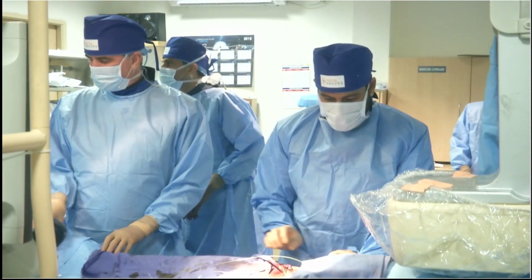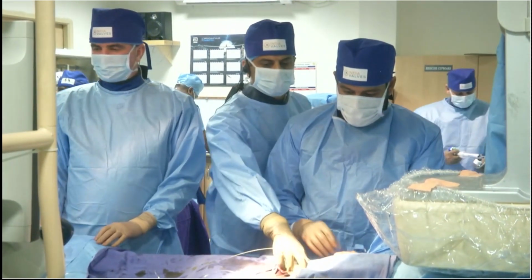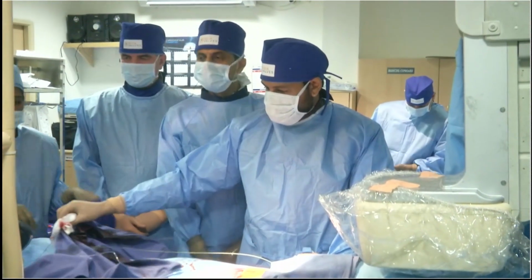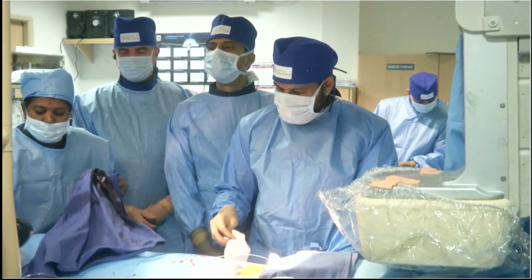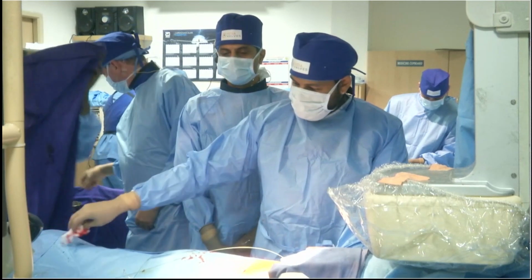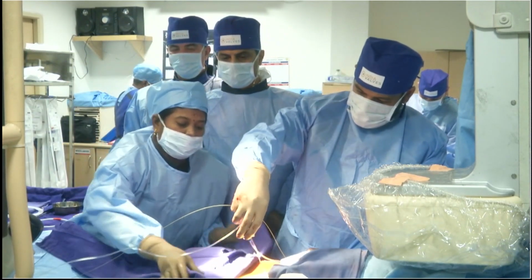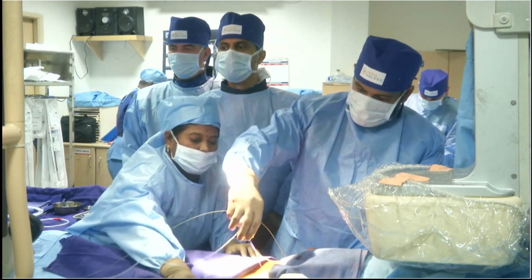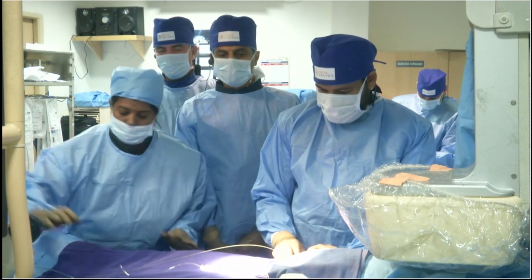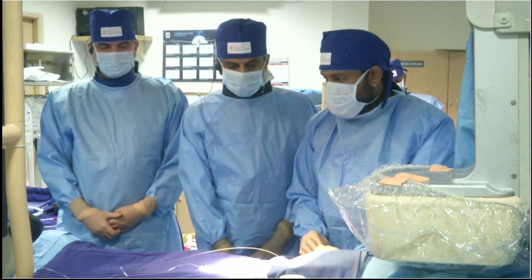So Sengottuvelu, what have you done till now? We saw you put the ProGlides. We discussed the 11 and 1 position. 2 parallel ProGlides can also work equally well, rather than angulating them. You just move them to one side and the other, and that works well. But what have you done now? Initially you put a 7 French sheath. We just put the ProGlides, and now we put an 8 French sheath after the ProGlide.